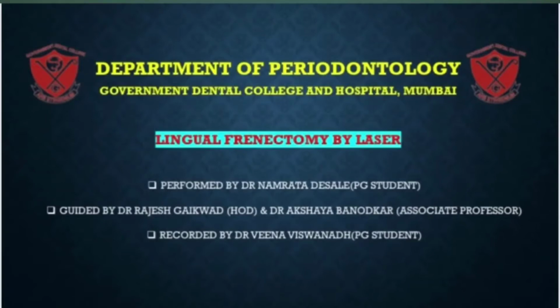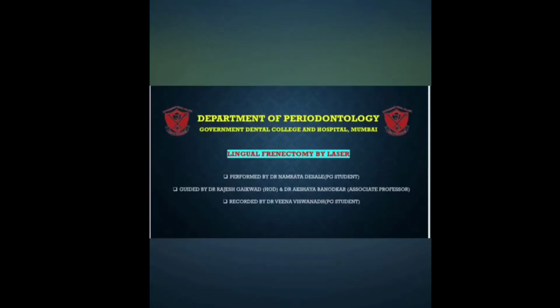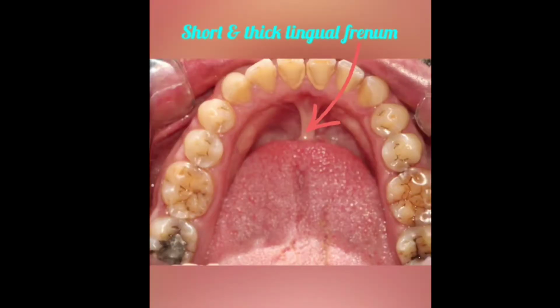Now we have some of the commonly performed periodontal surgeries: frenectomy and periodontal flap surgery. Tongue tie or ankyloglossia is a developmental anomaly of the tongue characterized by an abnormally short, thick lingual frenum resulting in limitation of tongue movement. Lingual frenectomy is advised for the management of ankyloglossia. The advent of lasers has undoubtedly made this procedure more comfortable for the patients with fewer postoperative complications.